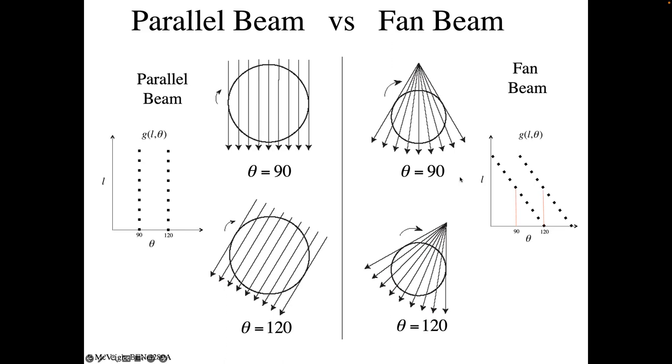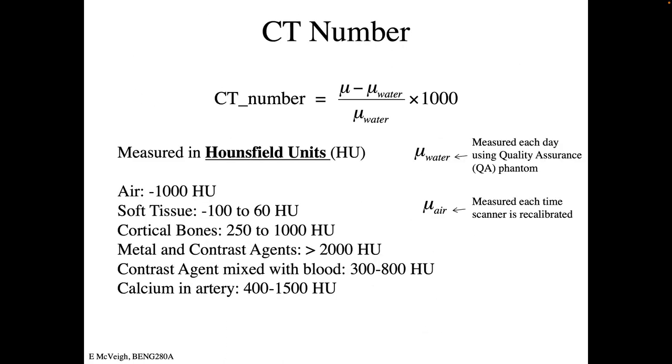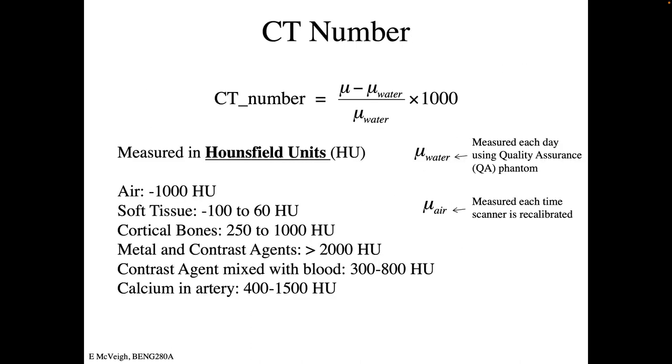architecture. There are very explicit algebraic ways to just turn your data obtained like this into data that's assumed to be taken like this. As you can imagine, just mapping these points over to here. Okay, I think we just went through the whole explanation.